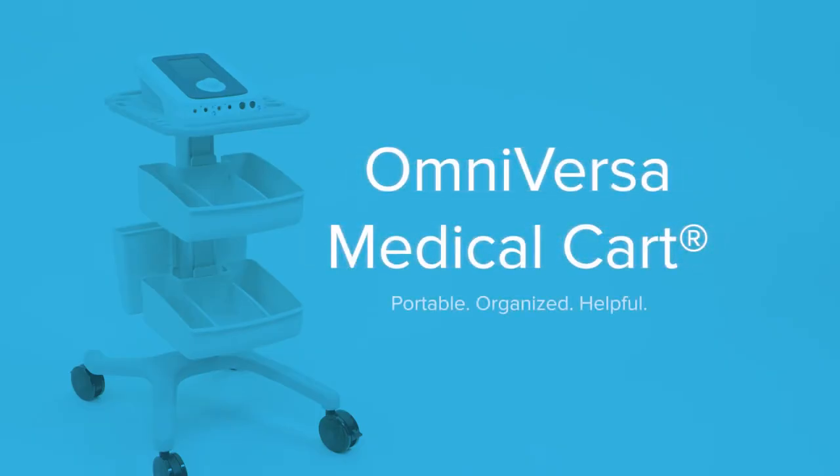Portable, organized, helpful. The OmniVersa Medical Cart from ACP.